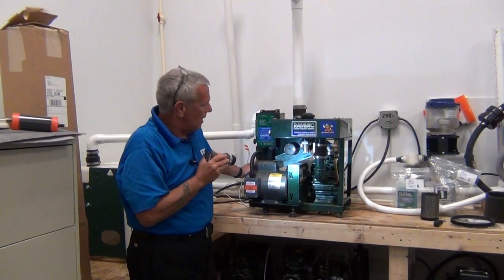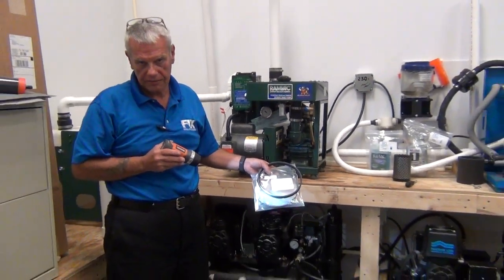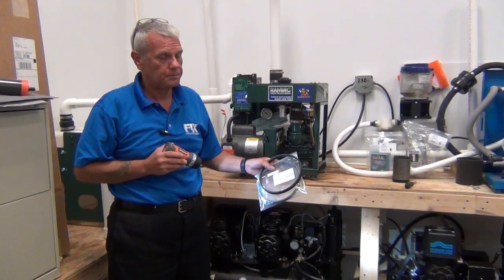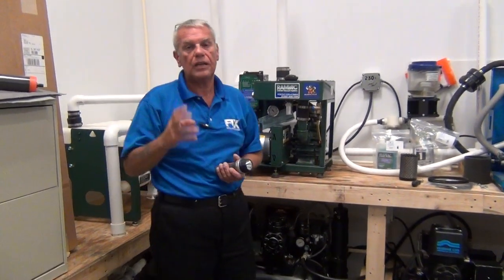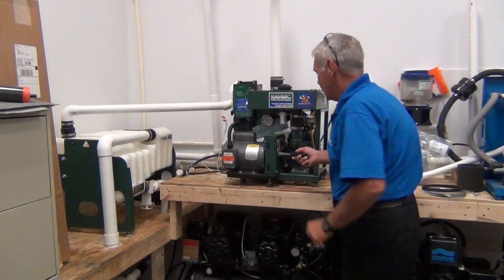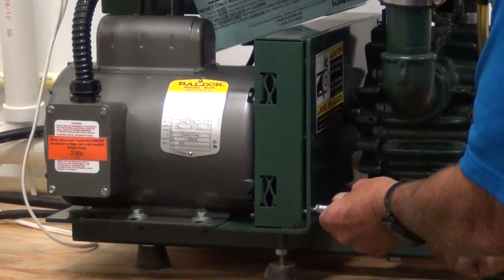Now we're going to check our belts. These belts are available from DCI through parts at DentalFix.com. I would advise you to keep a couple of belts with you. They're relatively inexpensive, and the doctor is dead in the water without the belts — and you cannot find these belts anywhere; I have tried. The only place to get the belts is from the vendor. So all that being said, I have removed most of the screws on the belt housing except for two. I'm going to take those off right now, and we're going to check the belts.